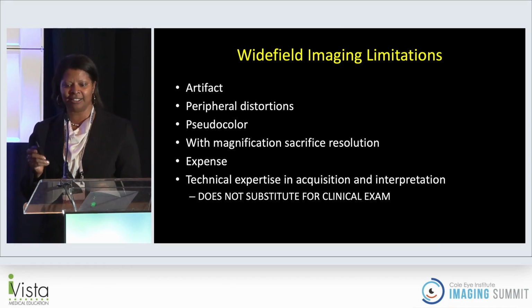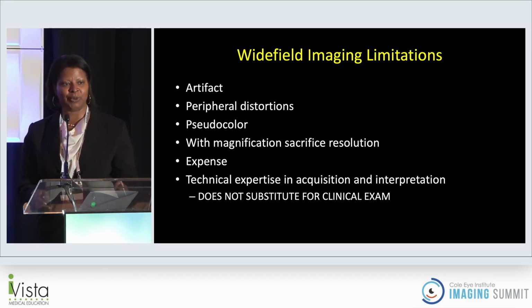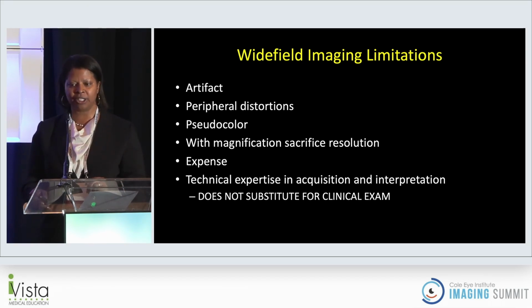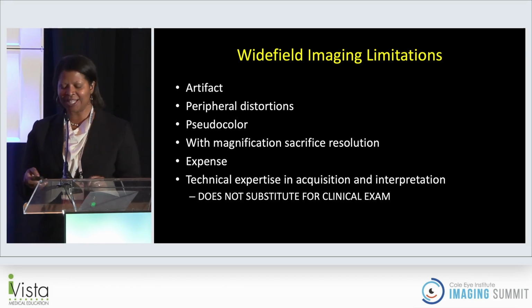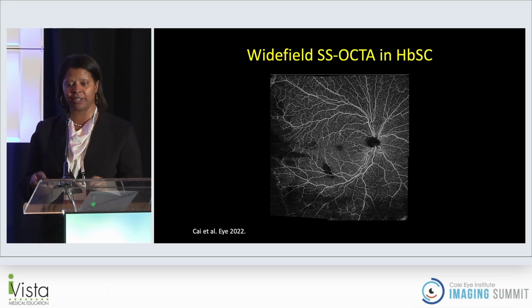And it does not substitute for clinical exam. That's almost how wide field imaging became very popular among people who thought, oh, it's a retinal tear, I don't have to examine the patient, I can just take an ultra-wide field image. But you can get burned during that if you really don't know how to examine the patient and be able to corroborate what you think you're seeing on the imaging.